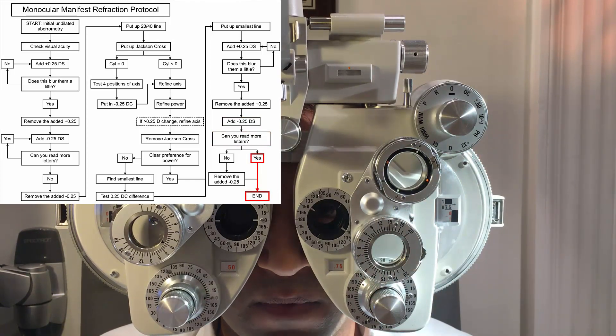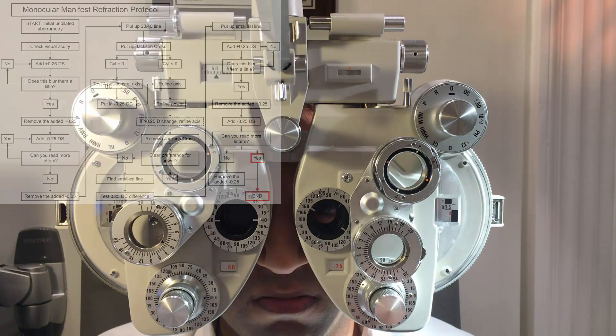And the smallest you can see now? H. Is it HC? Something, something, O. Very good.